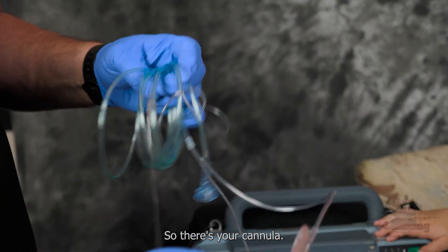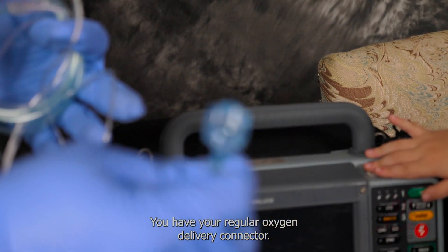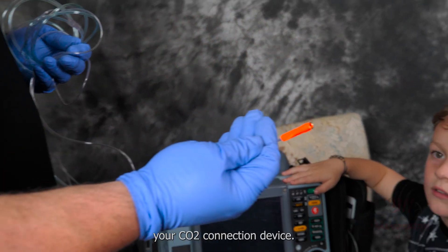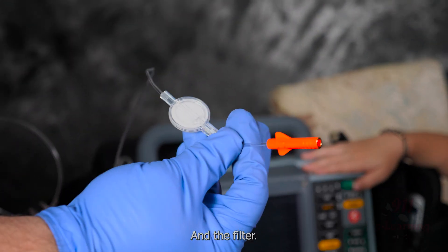So there's your cannula. You have your regular oxygen delivery connector, and then you have your CO2 connection device and the filter.